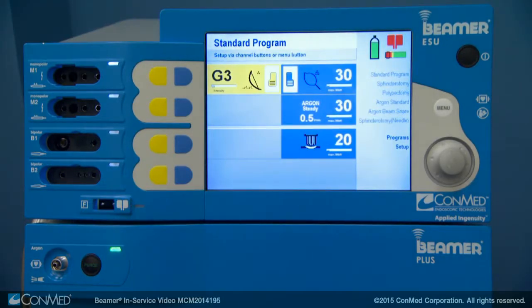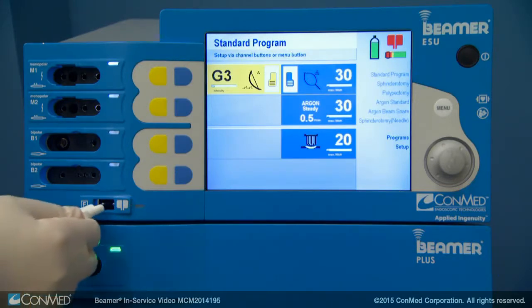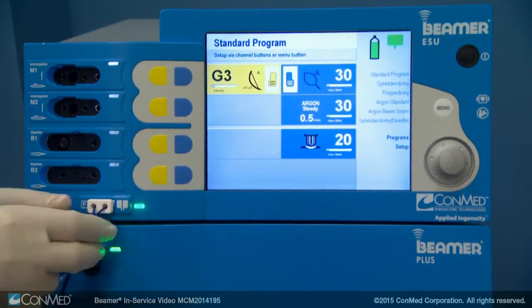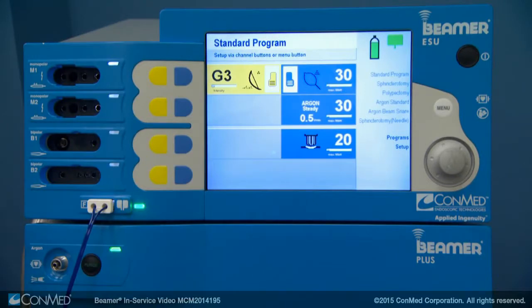Dual foil dispersive neutral electrodes are recommended, but use of a single foil dispersive neutral electrode also turns the light green, although it doesn't need to be applied to the patient to do so.